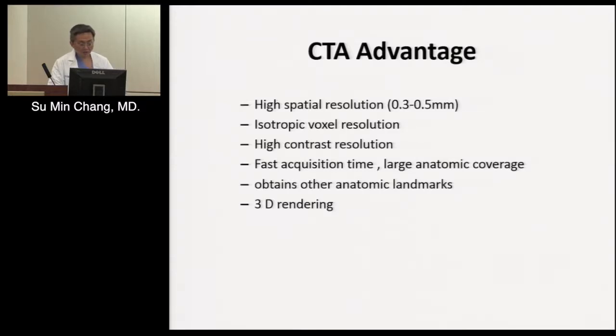And obviously, different from echo or nuclear, you can obtain images outside the heart, which is very useful for some surgical planning.